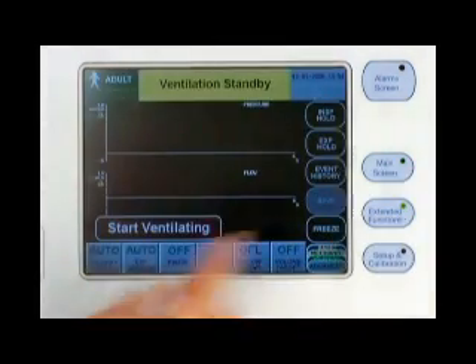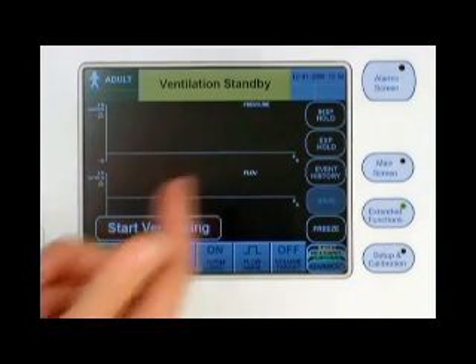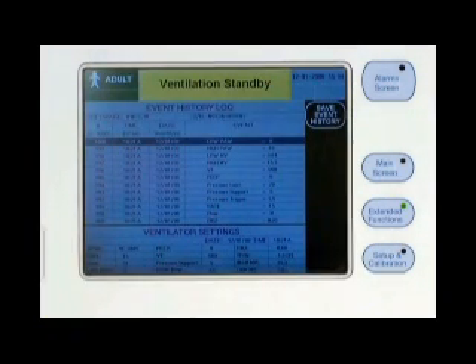The extended functions menu button gives you access to the inspiratory and expiratory hold maneuvers and to the event history log, which stores the last 1,000 ventilator events. The primary menu allows you to freeze screen images for storage and download. The secondary event history menu also allows you to save event history logs for storage and download.